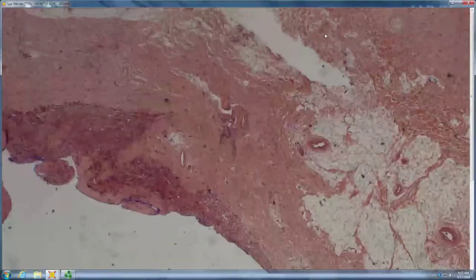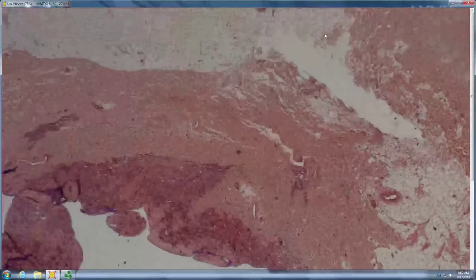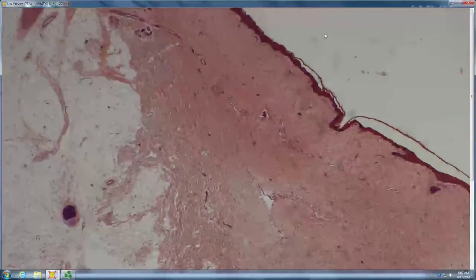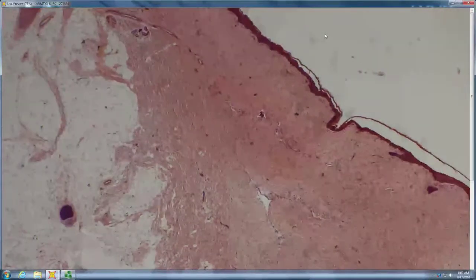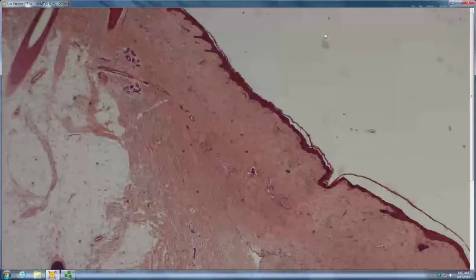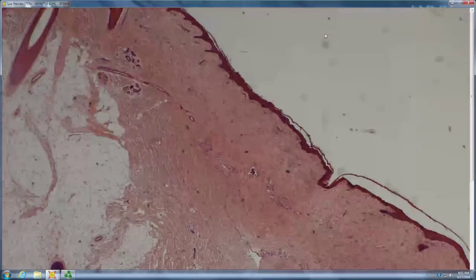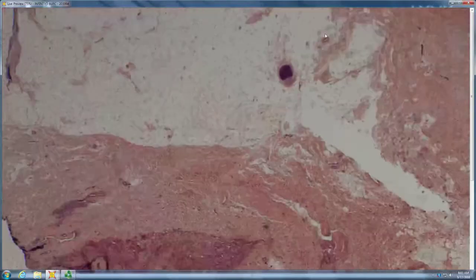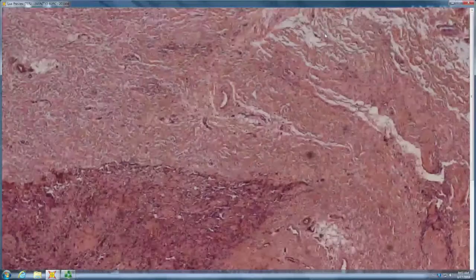Missing hair. So maybe like a nevus sebaceous, possibly. Do you see anything that looks like nevus sebaceous there? Well, like a prepubertal was what I was thinking. Do you see little vertical hair germs lined up? No. Or does it look more like scar? It looks more like scar. What would you call a hairless patch with scar in a kid? Like aplasia cutis. Like aplasia cutis, and then what's underlying this aplasia cutis?